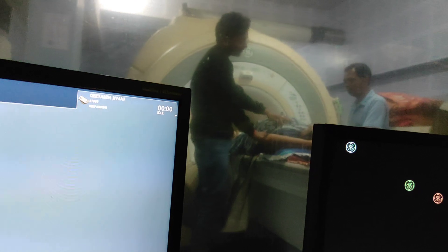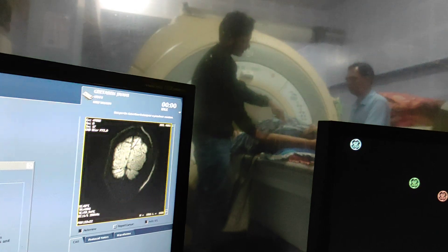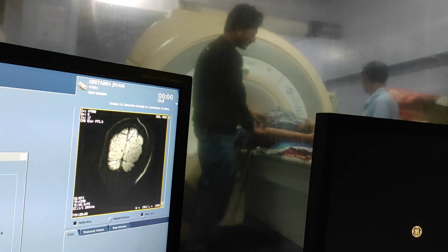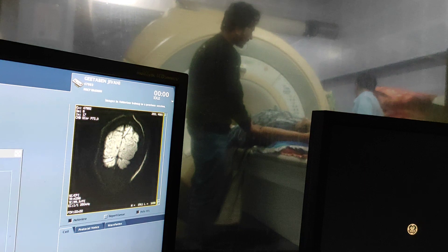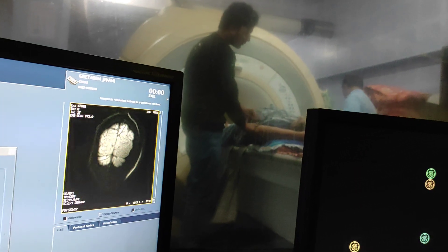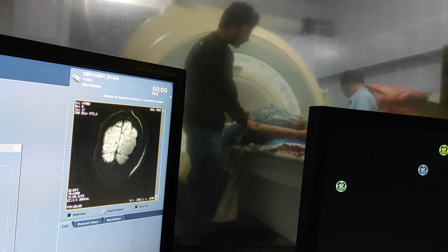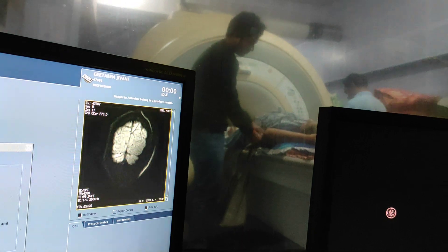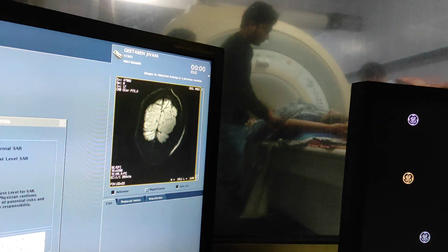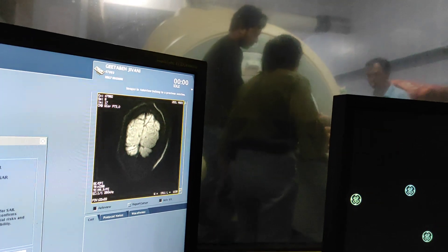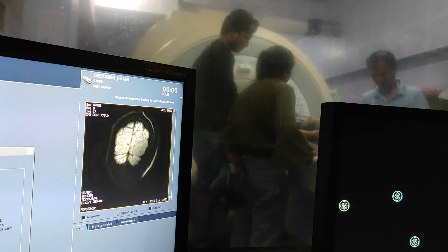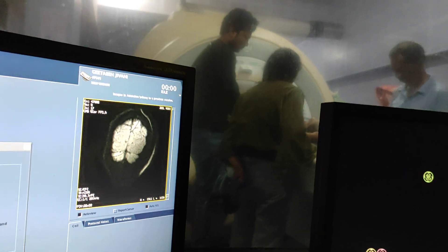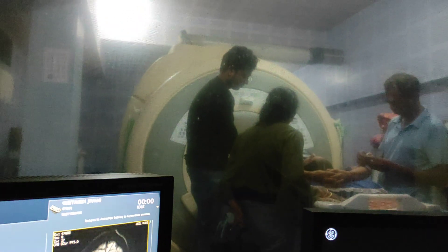Patient position is feet first. Body area coil 2-3 or 3-4. You have to fix the respiratory bellow before starting the scan. Respiratory bellow is needed and peripheral gating is also needed.